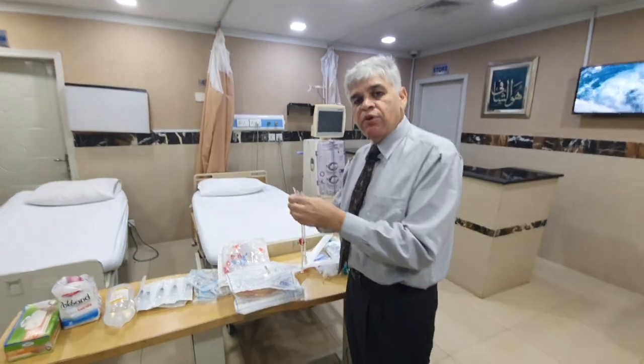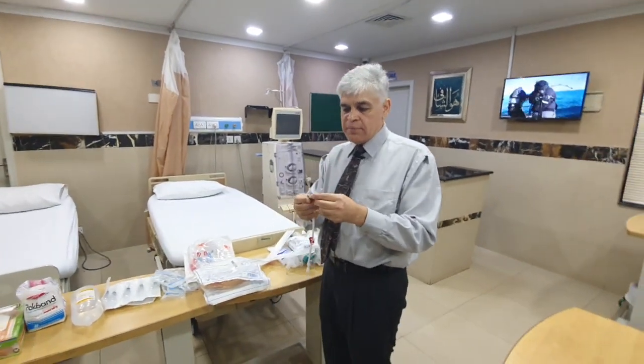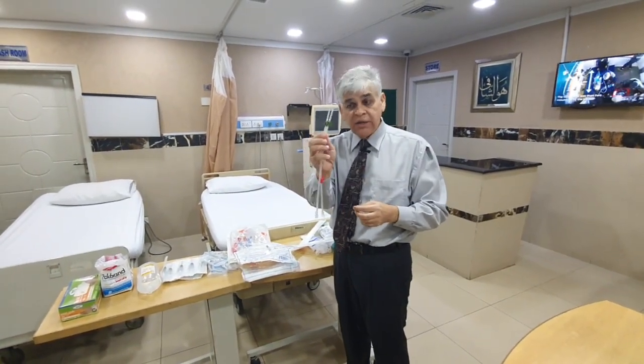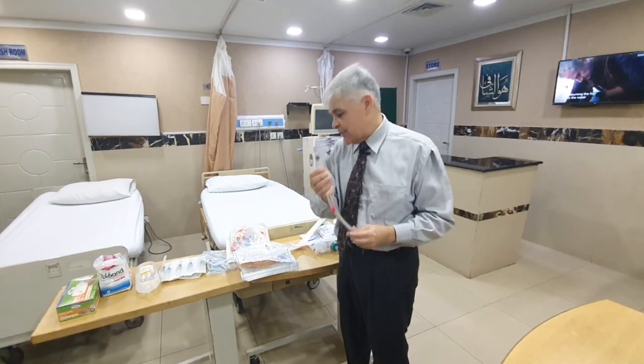So this is very important, but there are lots and lots of these needles available in the market which do not have this bore. But if you've got this bore, then this is a very good quality needle, because it will give you better results when it comes to dialysis.